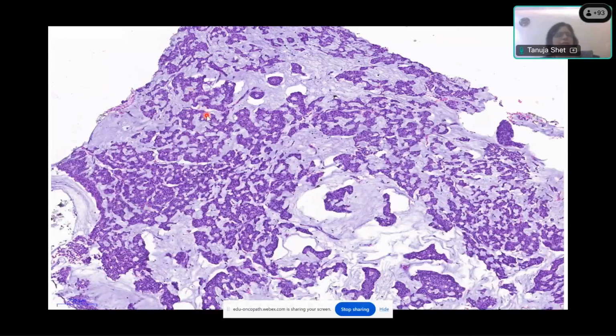Now, who's the next in line? Would you like to describe, Monica, Pratyusha, would you like to describe this tumor? No? Do you see mucin? Epithelial tumors, nascent cords arranged in desmoplastic stroma, man. This is not desmoplastic, this is mucin, child, because I told you, even on radiology, it had mucin, right? Yes. So one important thing is that means you've not listened to my pattern.